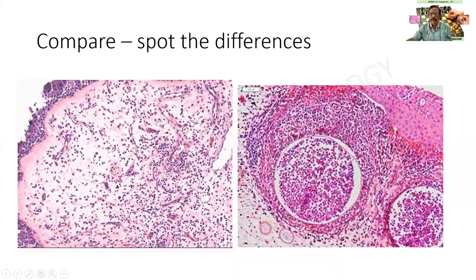I would like you people to compare these two because both are slides for you people. In one, I am finding the epithelium, edema, and dot-like inflammatory cells. These are the capillaries. So it is an inflammatory polyp, obviously. In another, apart from all this, I am finding a large sporangia. In fact, two sporangia are there, and they are filled with endospores. So it is a case of rhinosporidiosis. This is a pseudostratified epithelium that we see.